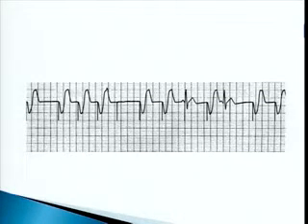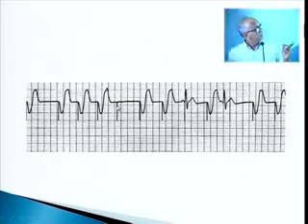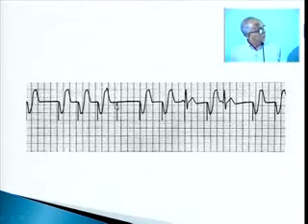Here, this is how we can make out. See, here there is a signal, but there is no contraction. That means it is not contracting. That probably the battery is failing. Similarly, see, here over the QRS there is a spike. That means it is not sensing properly. So there is sensing failure and capture failure. That means the pacemaker is malfunctioning. This is the time to change.